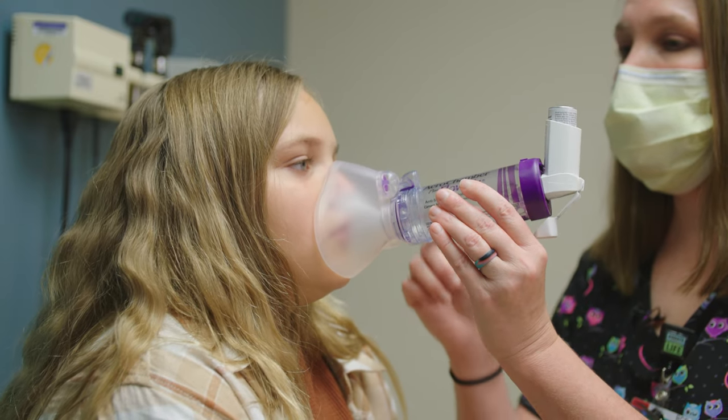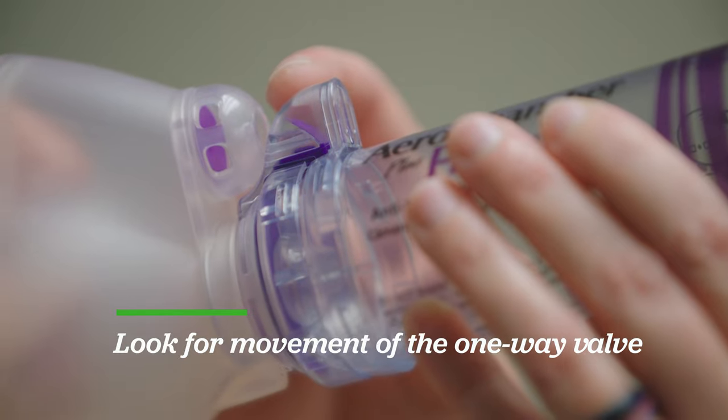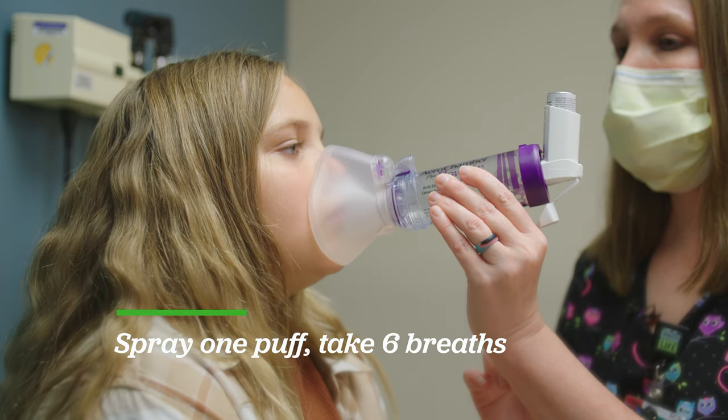We're going to put it on her face. You want to make sure this little flap is moving in and out — that's how you know you have a good seal on her face. You'll press down one time and now she's going to breathe in and out six times.